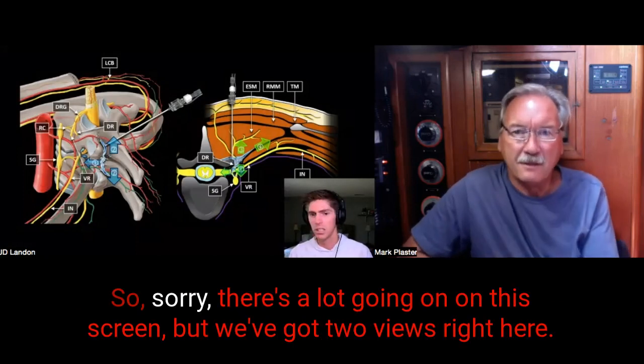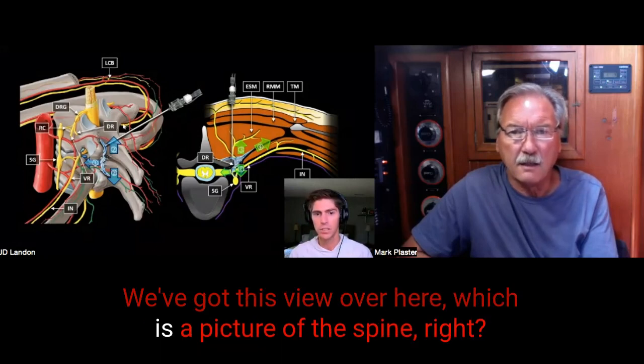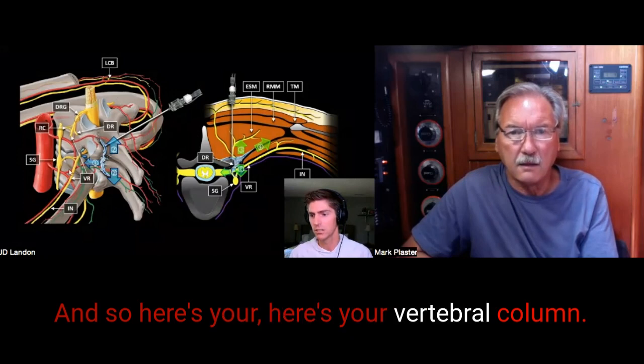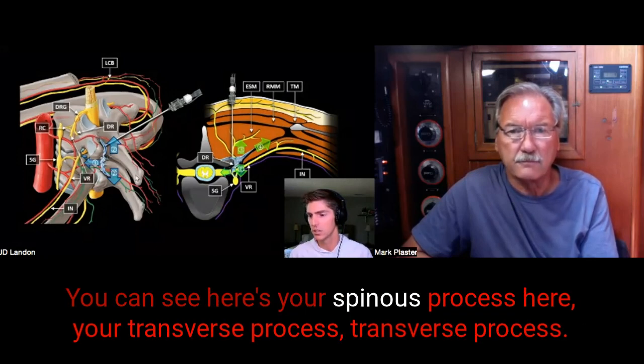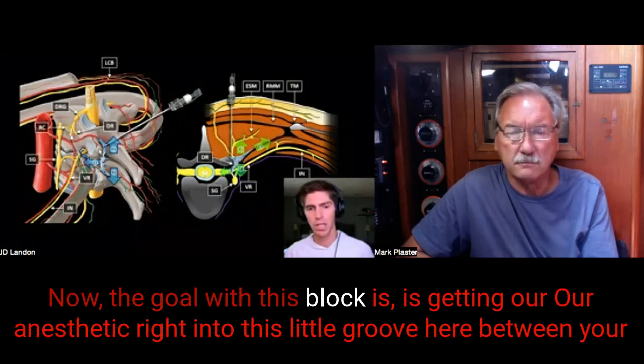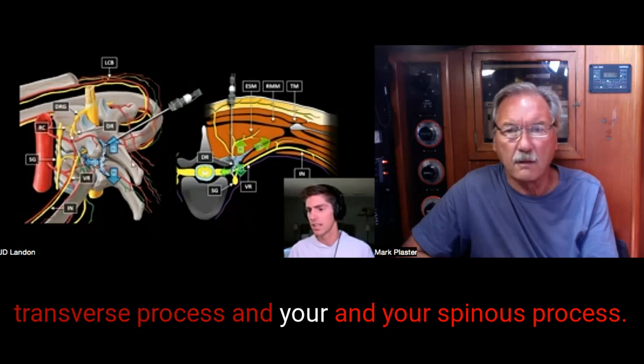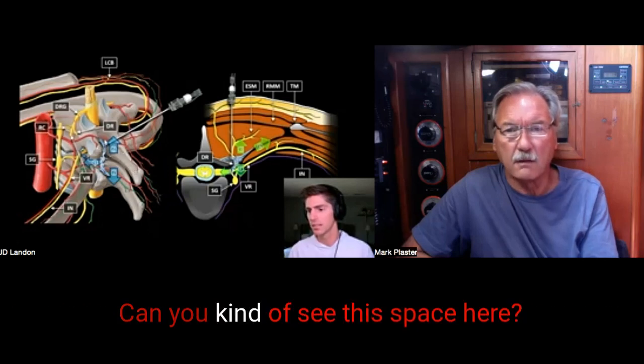Okay. Sorry, there's a lot going on this screen, but we've got two views right here. We've got this view over here, which is a picture of the spine, right? And so here's your vertebral column. You can see here's your spinous process, your transverse process. Now, the goal with this block is getting our anesthetic right into this little groove here between your transverse process and your spinous process. Can you kind of see this space here?